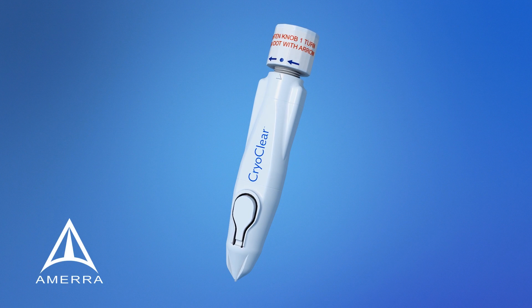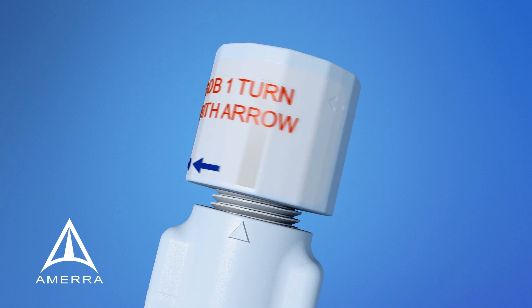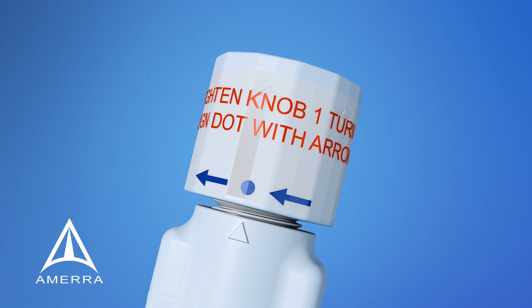To activate your new CryoClear pen, hold the pen firmly in one hand, and with your free hand, turn the knob clockwise one full turn. Turn the knob so that the blue dot on the knob aligns with the white arrow on the top of the pen. Your CryoClear pen is now activated.